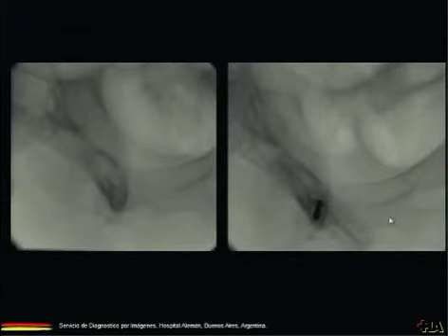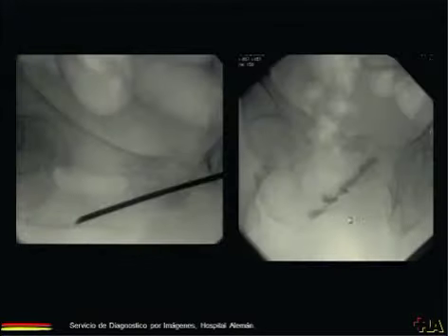It's like vertebroplasty, where we have the target, the pedicle. Well, this is just a longer pedicle. This is a real patient. If this is the eye we target, this is the needle going along the inferior rami. What we do is inject just a little bit of cement, and then we put the stylet in the needle, and we withdraw the needle while we are pushing the stylet.